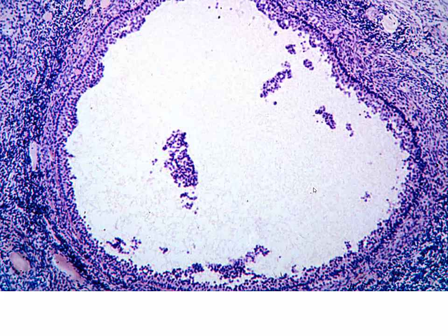This is an example of an atretic follicle. This is pretty easy. We can see all of these really dark pyknotic nuclei, but as these granulosa cells are detaching and free floating within the antrum in the liquor folliculi, that's also another example of the degenerating atretic follicle.